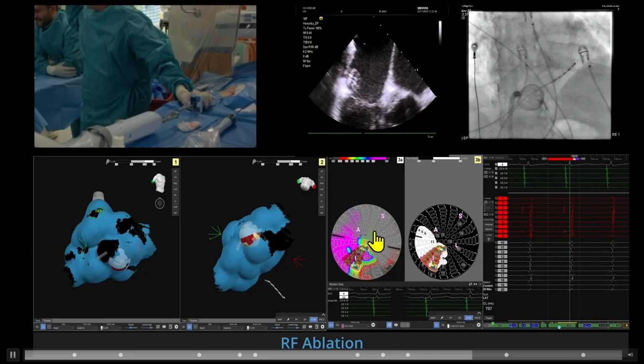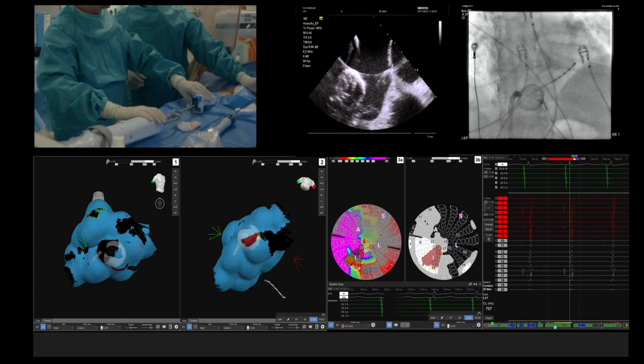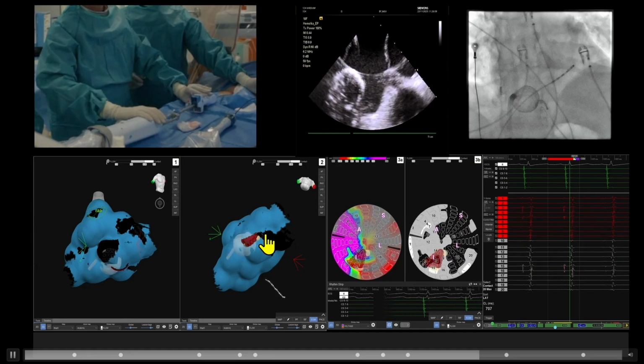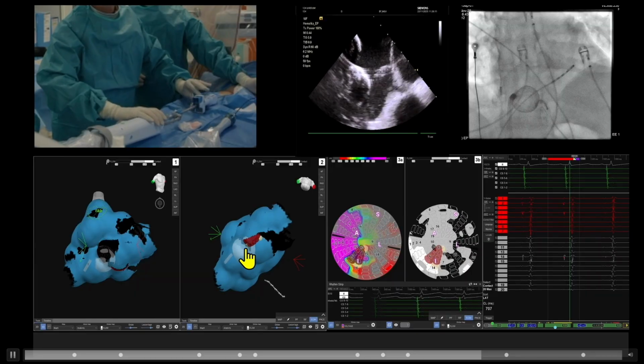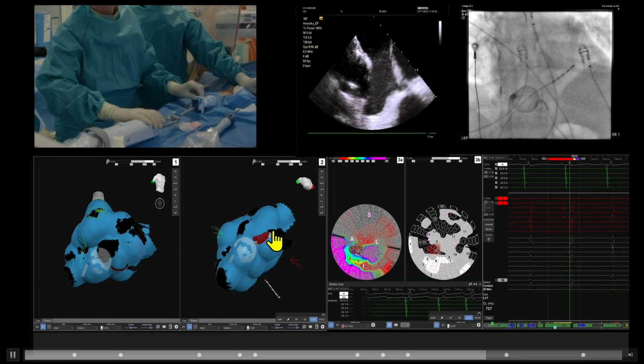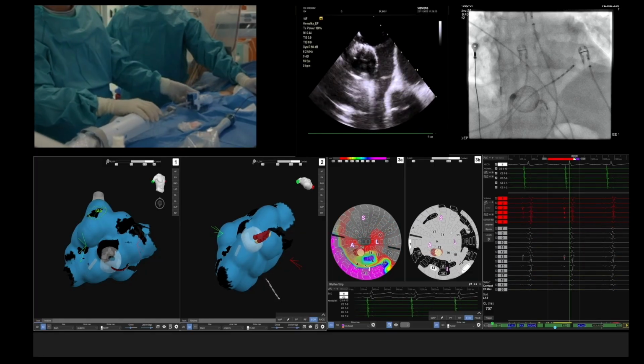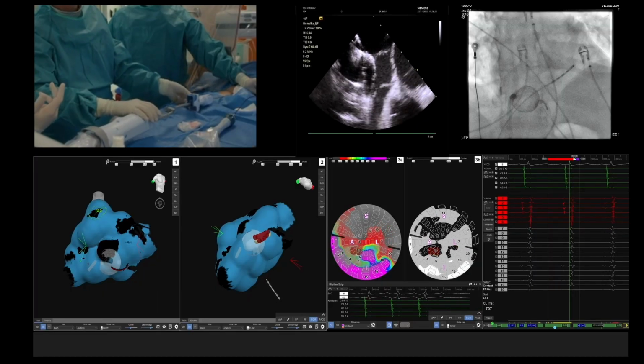So in this instance, I don't know where he is, but anyway, in this instance, we don't give nitro, obviously. So on the tricuspid side, we deliver RF lesion. Then we pull back, deflect. Now, I should say, when you deliver RF, the way this system works is it's not irrigated. It basically heats up to an ablative level, and it just waits.